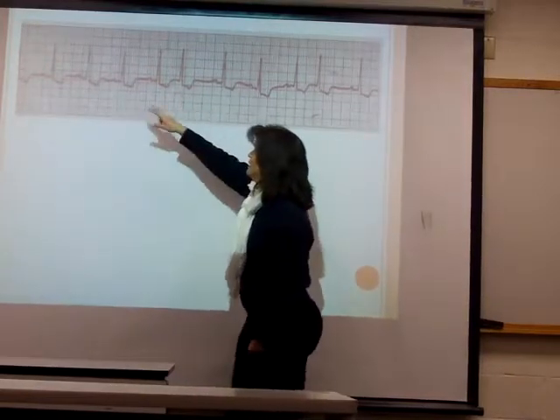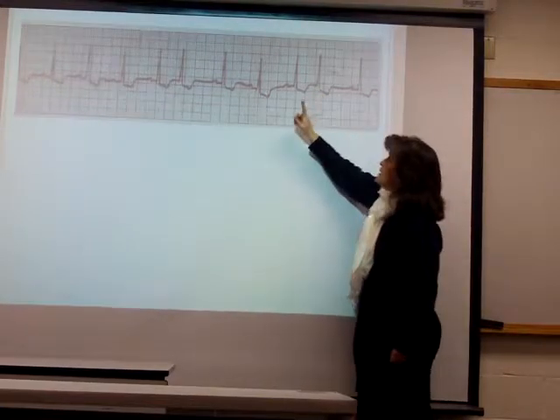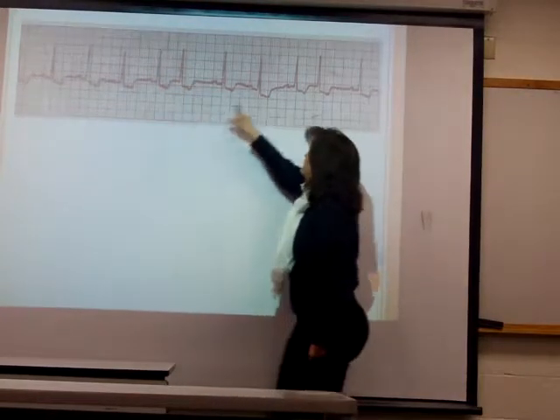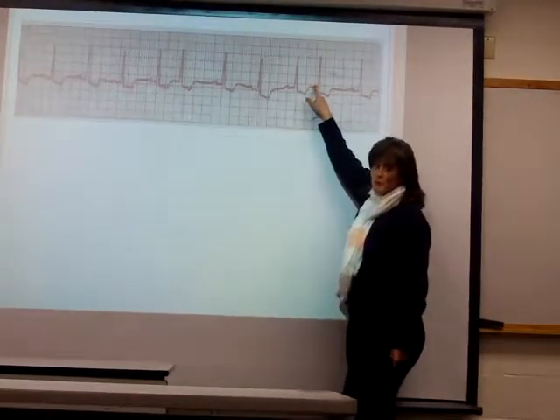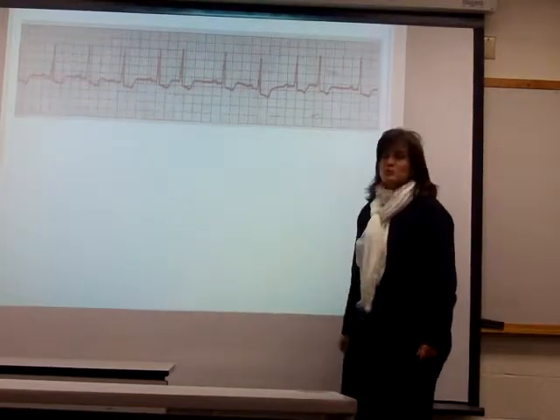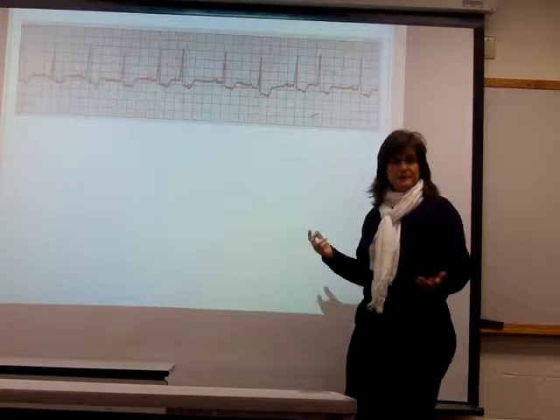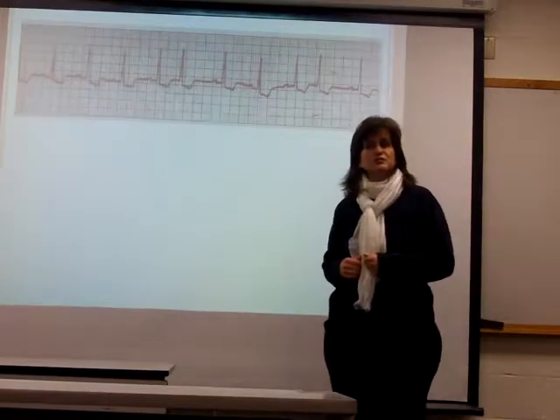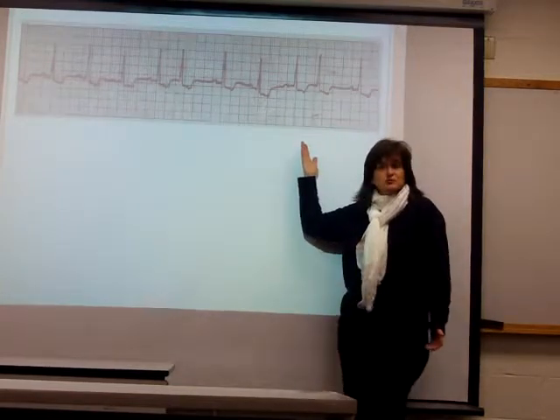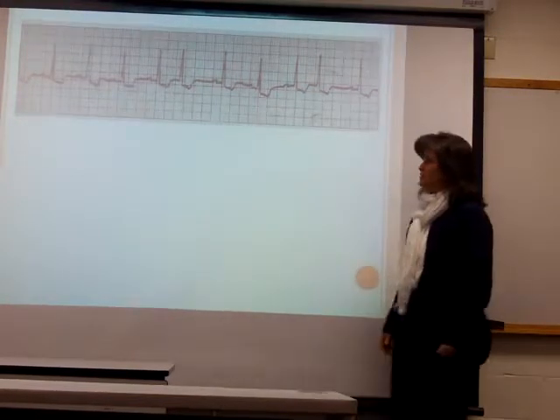But I have an early beat at the 5th complex and 9th complex, I believe, if I've counted that correctly. But when you look at those early beats here, you notice the P wave is absent. Same thing with here. There's enough room for that P wave to occur, but it's clearly absent. So this would be normal sinus rhythm with ST segment depression with 2 PJCs. What's my treatment? At this point, probably just oxygen because of the ST segment depression, okay? But obviously, if these PJCs are new, just like anything else that's changed, then maybe someone needs to be notified, most likely the cardiologist.